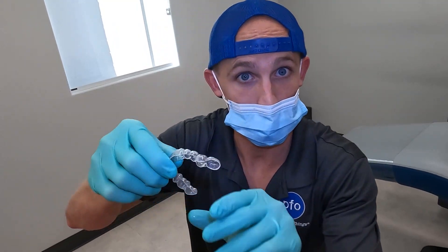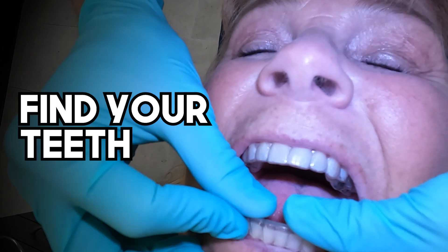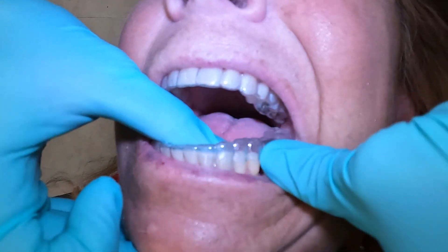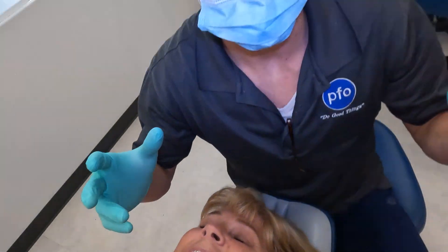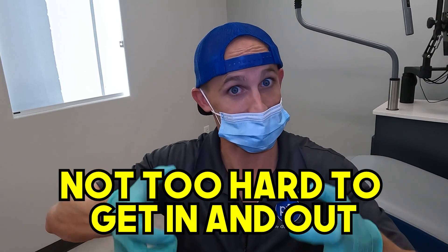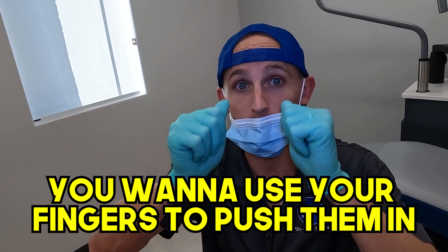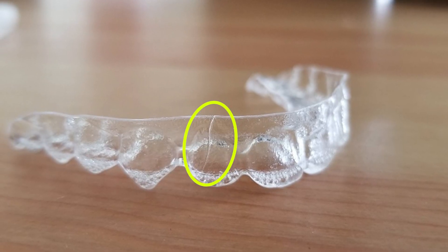Here's the bottom — we're gonna put that in using the same technique. Start in the front, find your teeth, watch out for your lips, and work it around. Sometimes if you're missing teeth or have really curved teeth, it makes the retainers harder to push in, but they should go in relatively easily and be passive. One important tip: when you're putting retainers in, don't bite them down — use your fingers to push them in. If you bite them into place without them being positioned correctly, you can crack or bend the plastic and be looking at a new retainer.